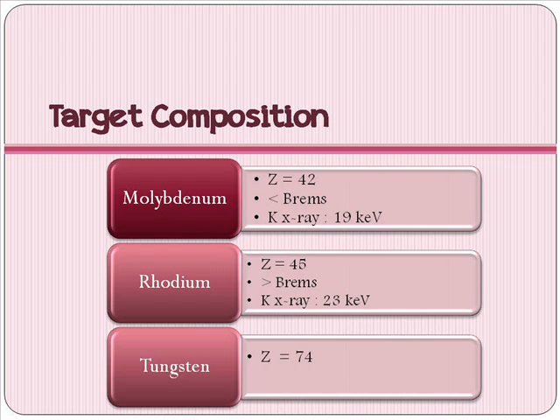Bremsstrahlung, which is a continuous spectrum, is more penetrating than the characteristic X-ray. And the effect of high-energy Bremsstrahlung is that it will reduce the contrast of the mammogram produced, so it is not good for mammography.